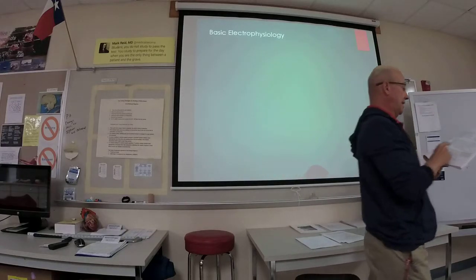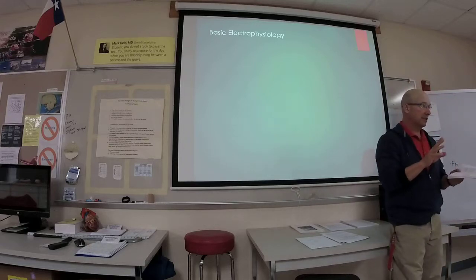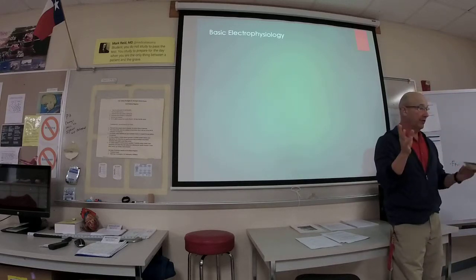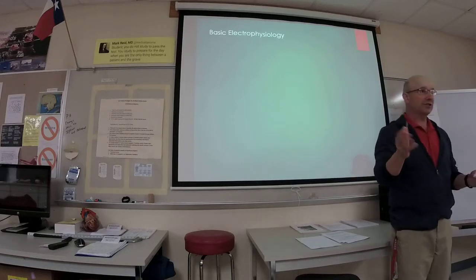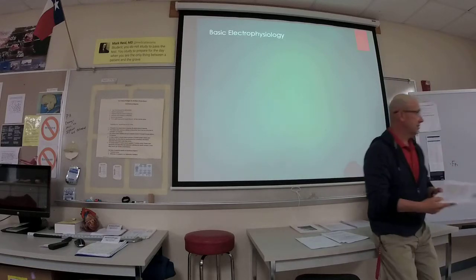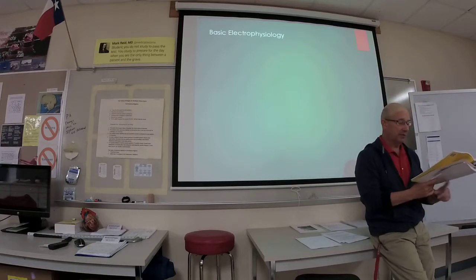And then 1 second equals 25 millimeters. These are great questions on that. Well, they're questions. I don't know about great or not. But they're questions on the review process. So 1 second equals 25 millimeters, and that's the standard speed for the paper.